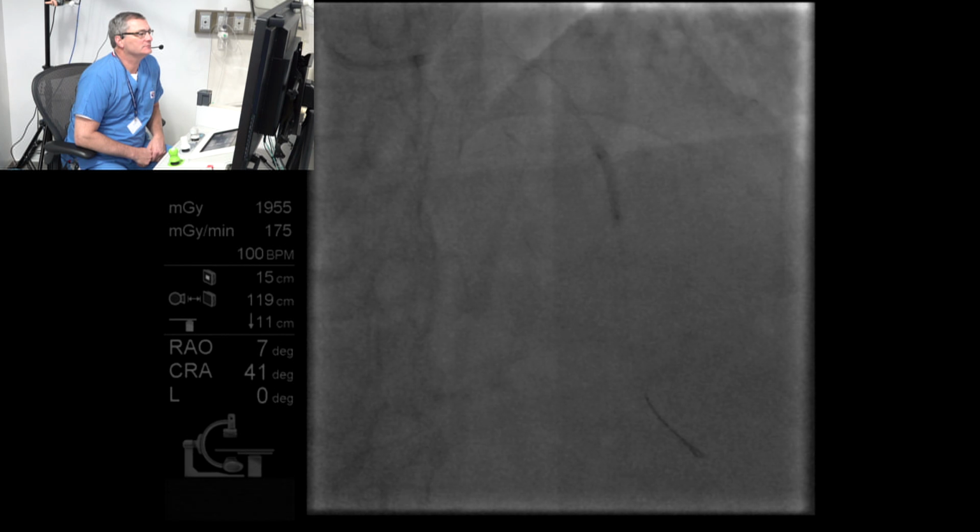What pressure are you at? 2.5 max. How high are you? How much? Okay. Just a minute. It hardly moved. All it did was suck my guide in. Okay, go ahead. 16. 18. And down.